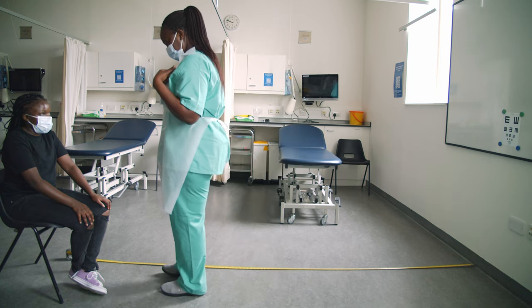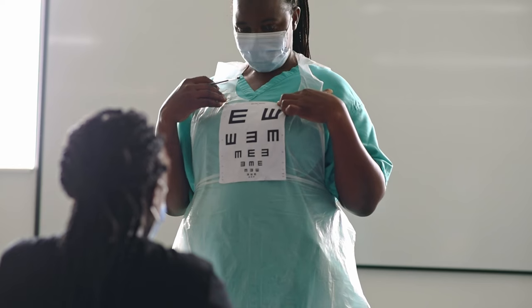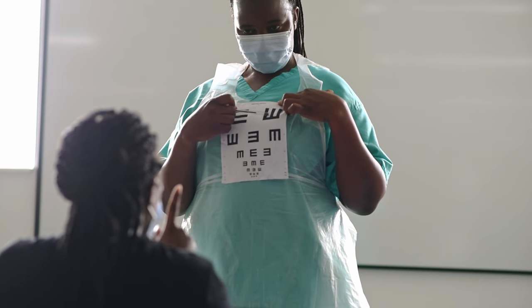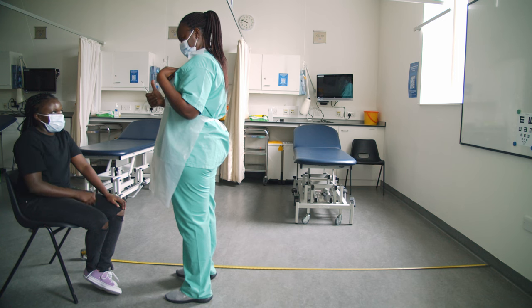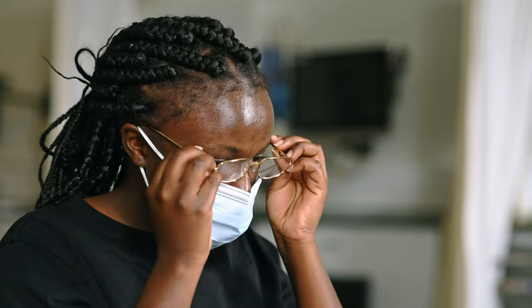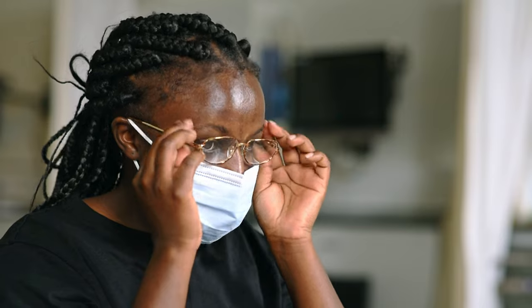Show the patient the chart at arm's length. Ask them to point in the direction of the E's point. Check the patient understands and you are both happy to start. If the patient normally wears glasses for distance, use them for the test. If not, then test unaided.